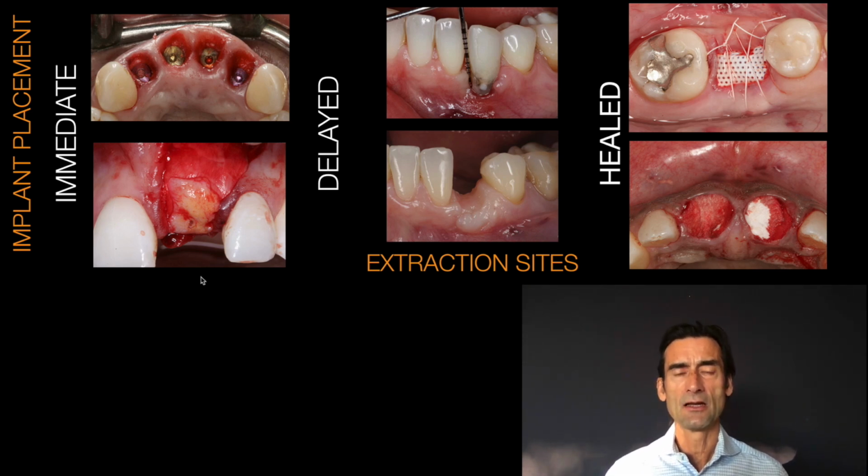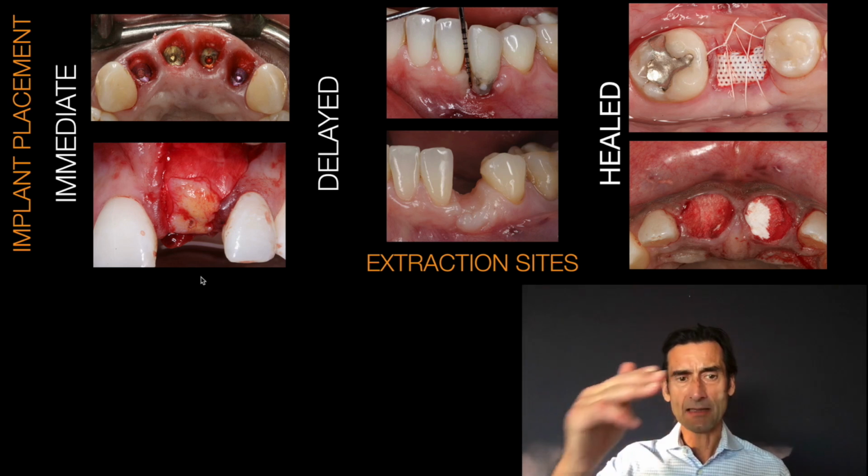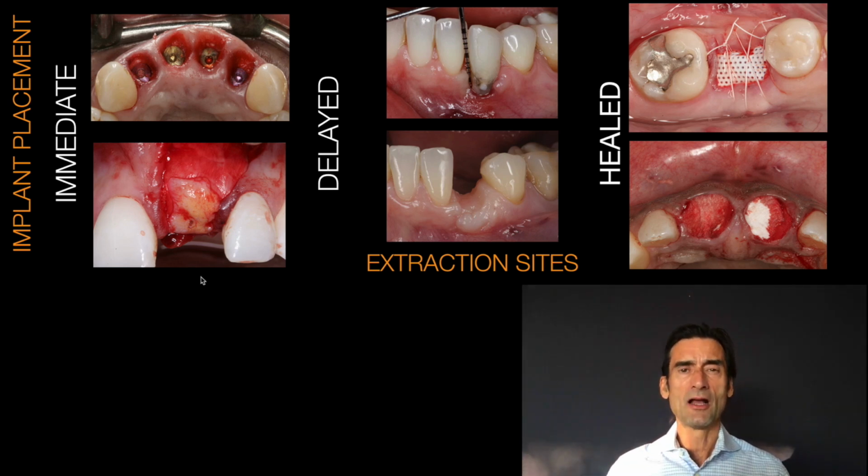For these cases, which I submerge and they're laying on the membrane more like a saddle, I actually prefer the palatal connective tissue graft. It's a little bit more fatty, so it kind of wraps better around the site. And this is just before submerging.